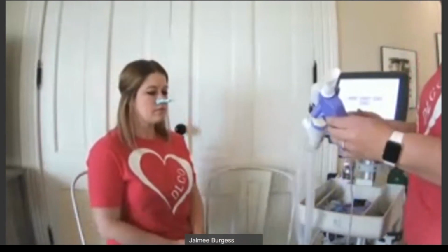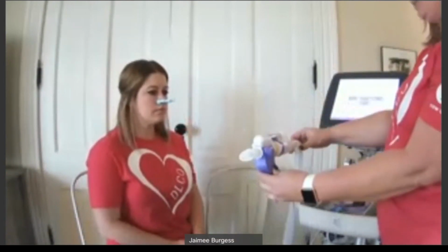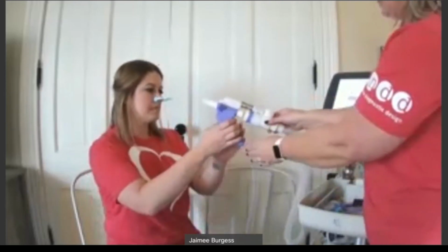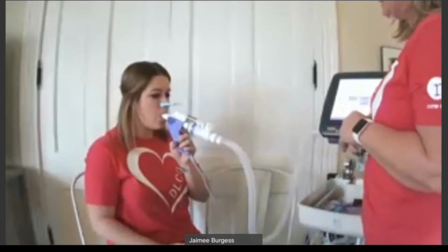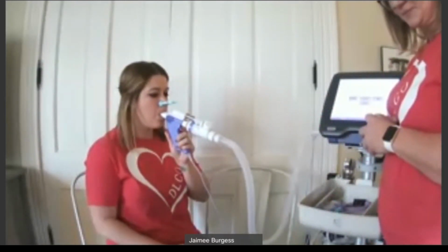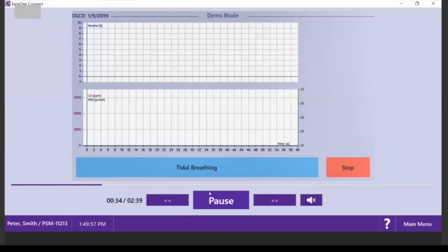With the Easy One Pro, we simply connect the two pieces together, and we won't do a full demonstration for you, but Jamie, I'm going to have you hold the purple hand sensor, wrap your mouth tightly around that mouthpiece, and just begin tidal breathing for me. So what Jamie's going to do is do 4 tidal breaths. We're just going to have the patient breathe in and out nice and easy. Go ahead, Jamie, and keep breathing normal.